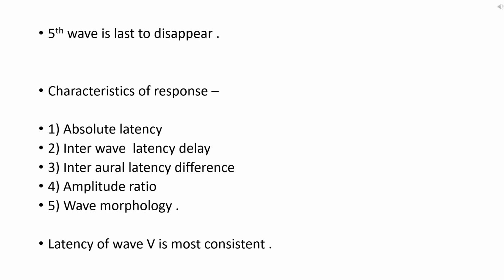So among all waves, we usually see that latency of wave 5 is most consistent. So it is a very important wave to study about the characteristic of BERA. So let's discuss about each and every response.